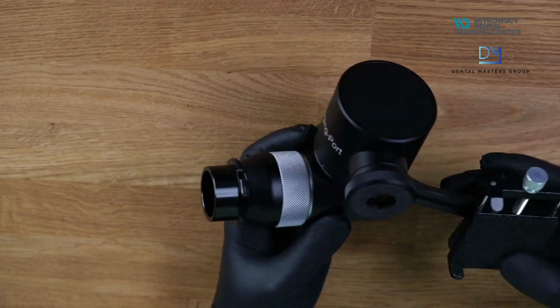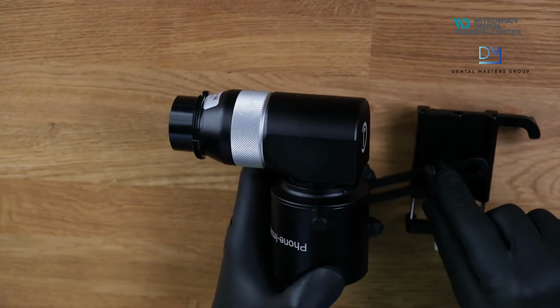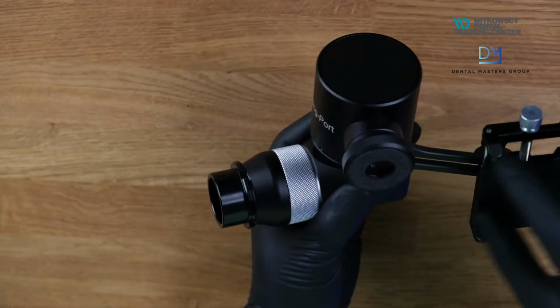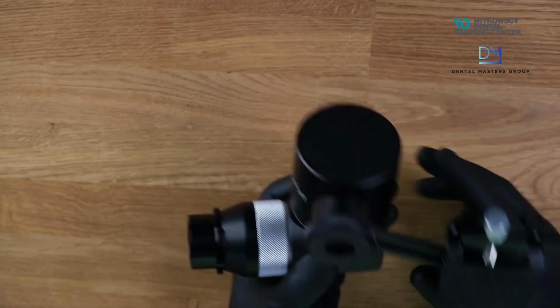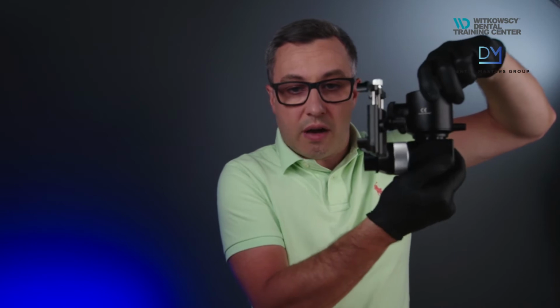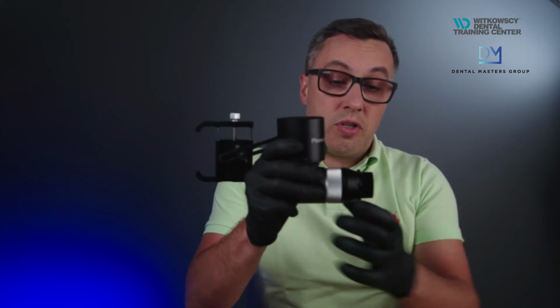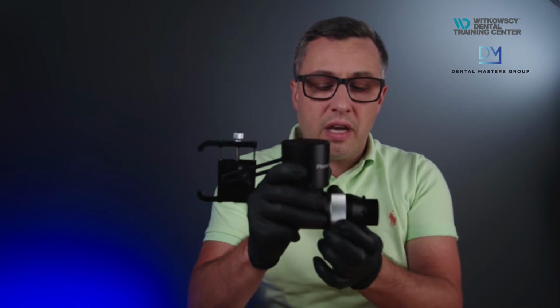And, you know, when I first installed this adapter, it was a little bit tricky because this part was really difficult to adjust. When you put the phone here, you need to move it a little bit up and down in order to position it. But when you first do it, you unscrew this little screw here, and then you position your phone here, and then it becomes easier. Another feature that we have is a little screw here, so we can turn this connector around and it doesn't influence anything except the comfort. Another thing that we have is the connection here, the little ring, which helps you to rotate the screen, and it will help you to see in a horizontal position.